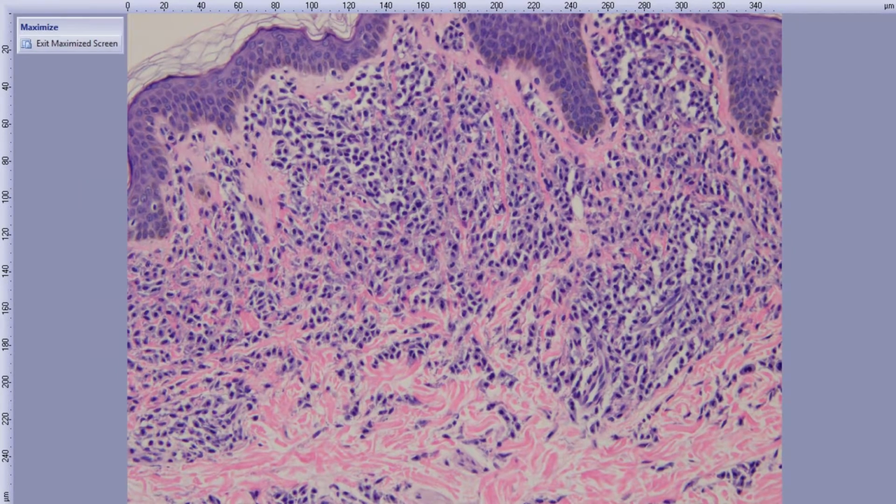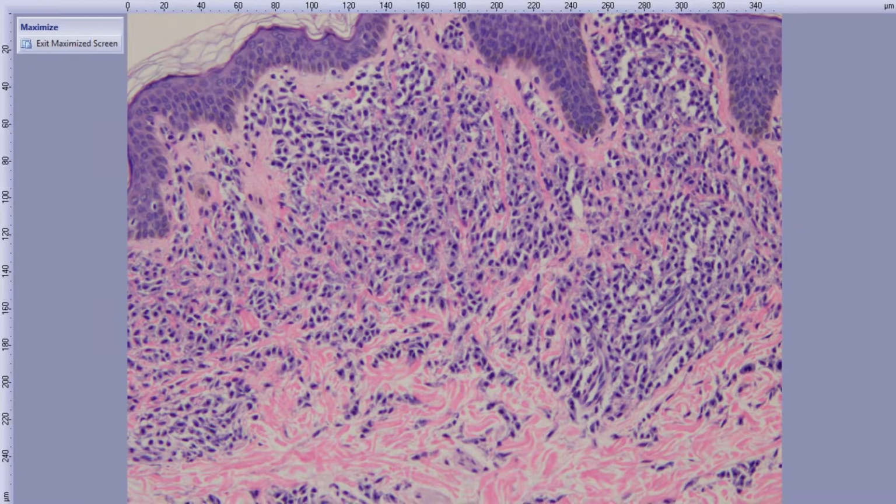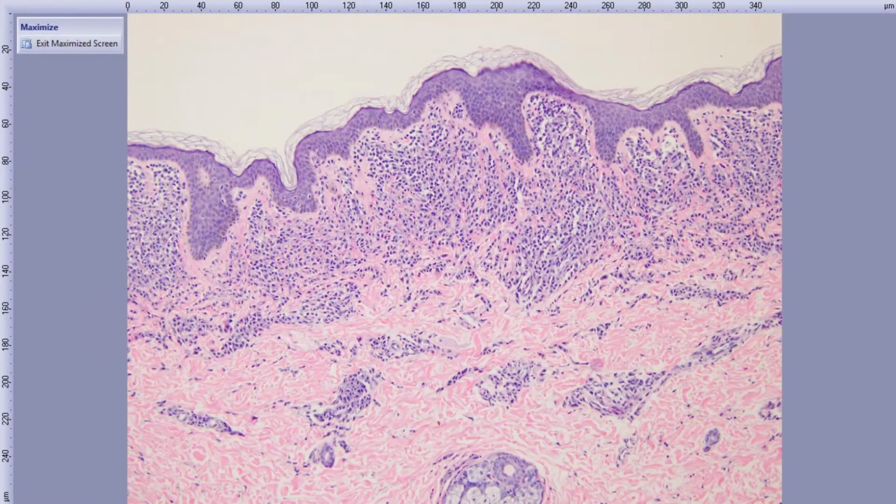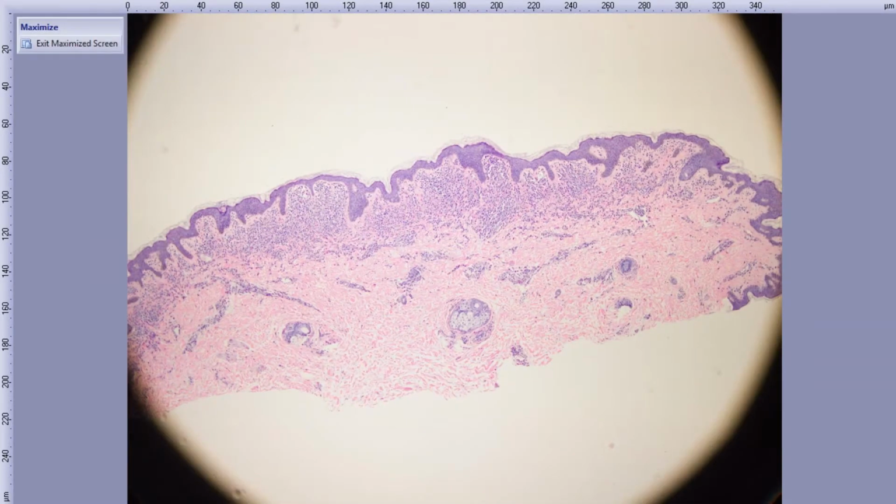Any stains that you guys can recall that you could do if you'd wanted to? That's right, CD117, which is the c-kit. Yeah, that's tryptase. There's also toluidine blue you can do. There's probably half a dozen different stains, but yep. So that's good. All right, urticaria pigmentosa or mastocytoma.